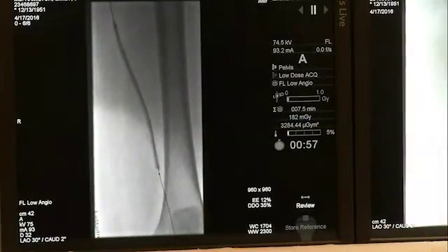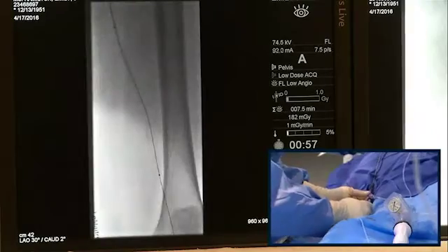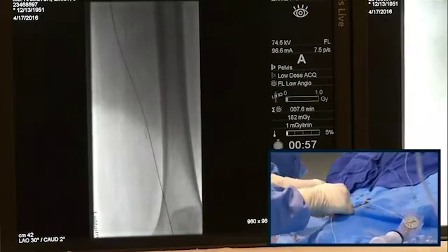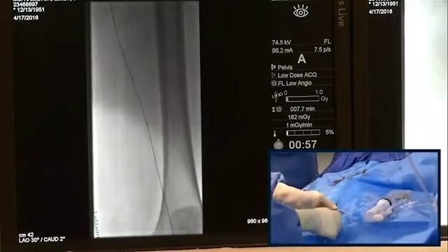The second point is that I agree with everyone. My plan was to do angioplasty, then take some pictures and then decide how we want to proceed, at least with the SFA. Given the swelling that she has and the AV fistulas, I think Viabahn is very appealing. So let's take a picture now.